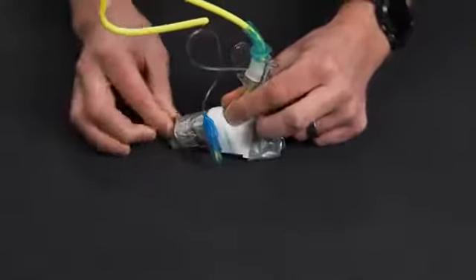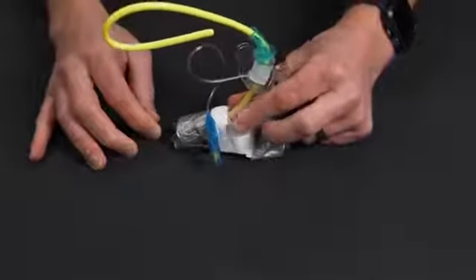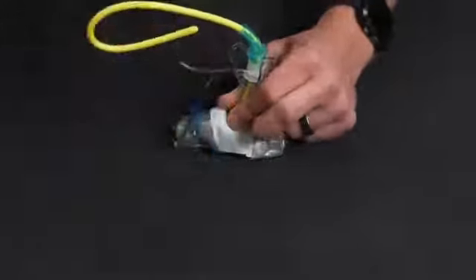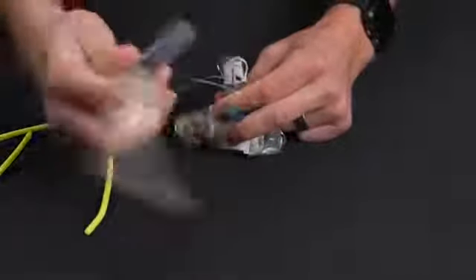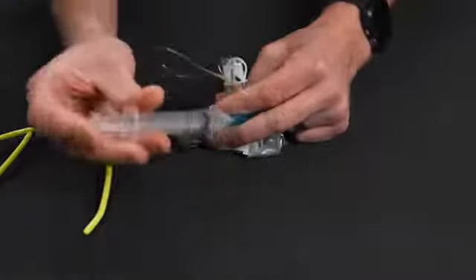So we have the tube in place, and granted I've blocked the end of this with duct tape, so it can't insert all the way, but we want to make sure the balloon is all the way into the trachea, but only so. We can then take the bougie out, make sure this is sitting right where it needs to be, and then inflate the balloon with the recommended amount of air.